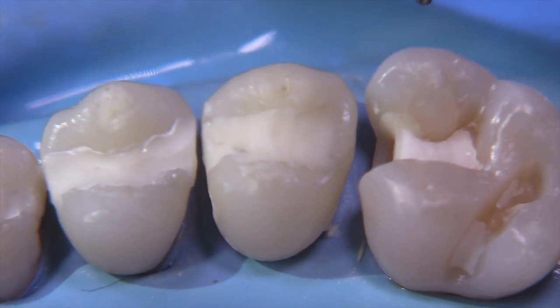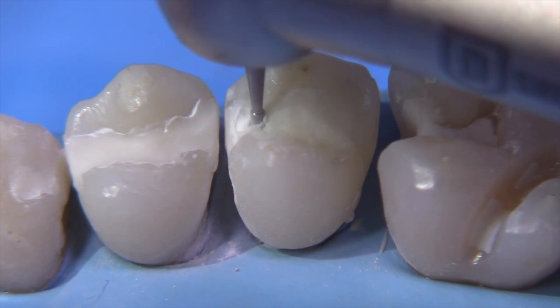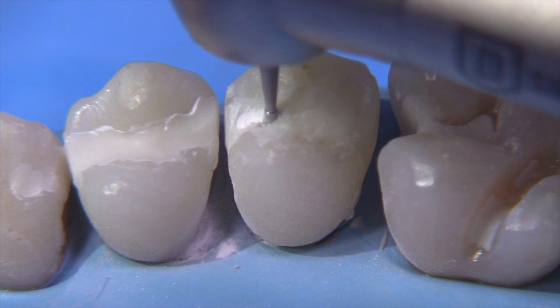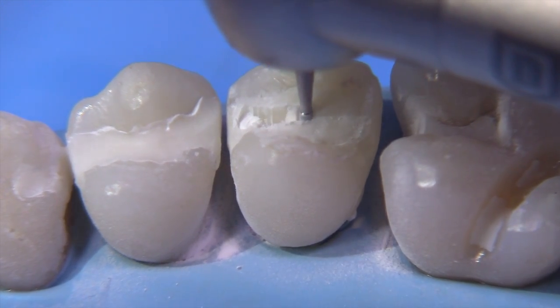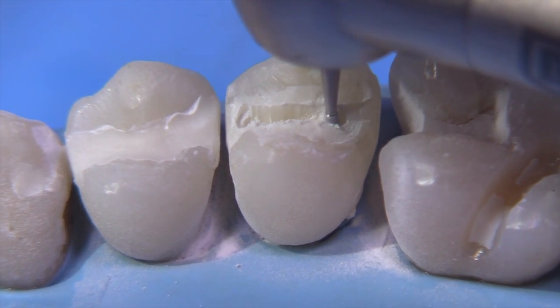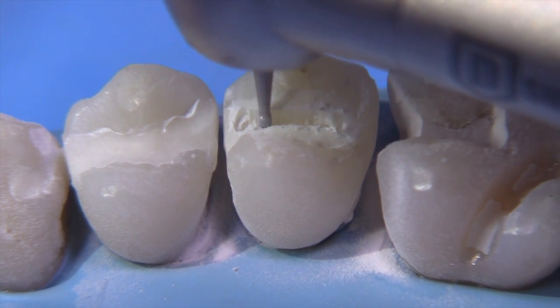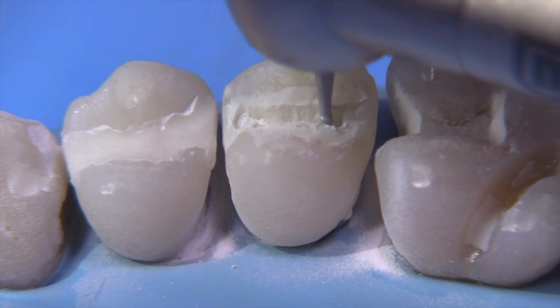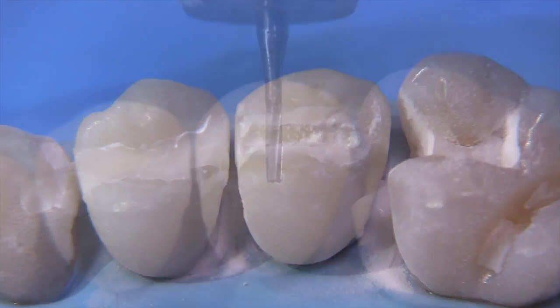Here's the 330 bur. We're going to use this to make our initial slit as we do in all of these techniques, 1.5 millimeters or so. We'd like to try to keep the 330 bur away from the walls because of its obvious shape, which would cause an undercut. We don't want to have to deal with undercuts — we want to start out with a nice straight wall that we can taper.